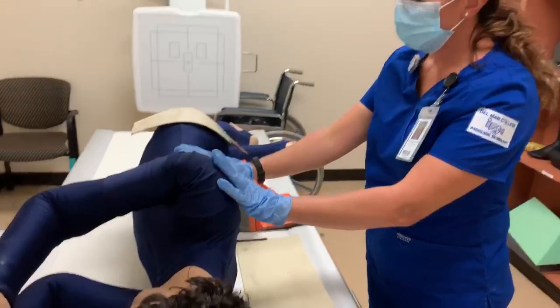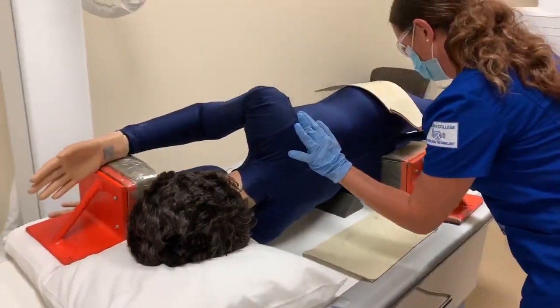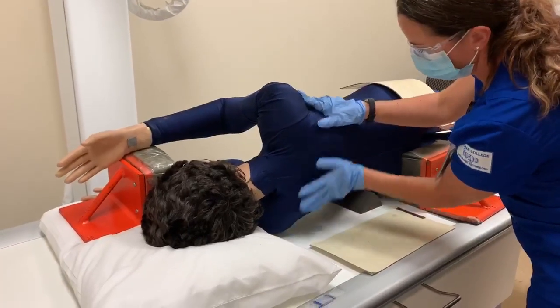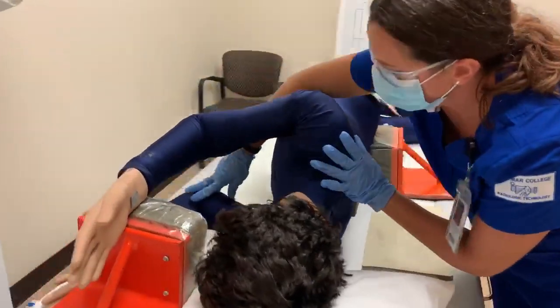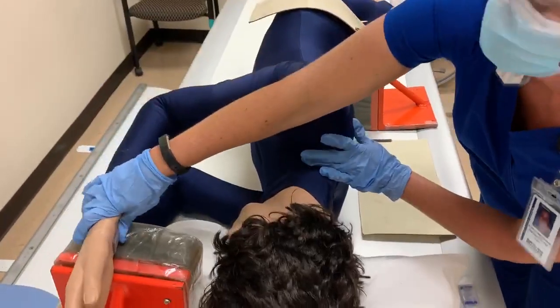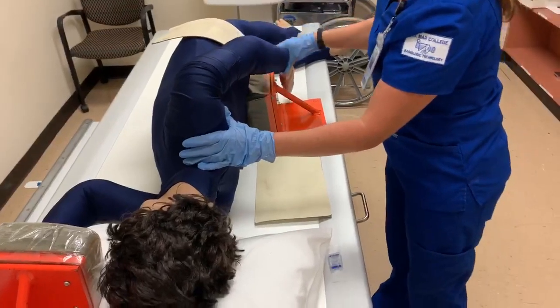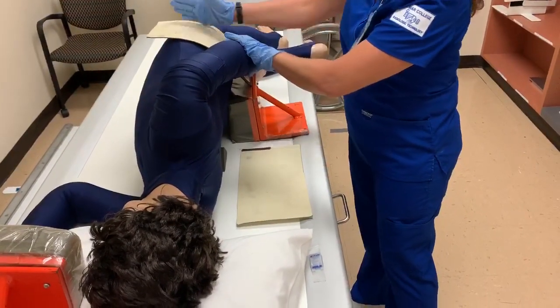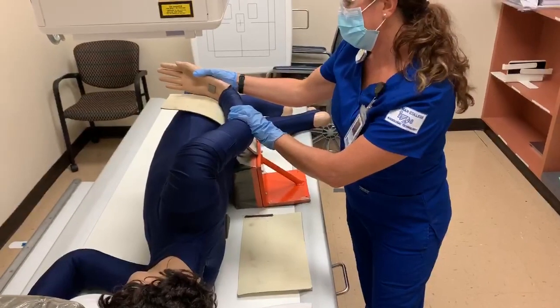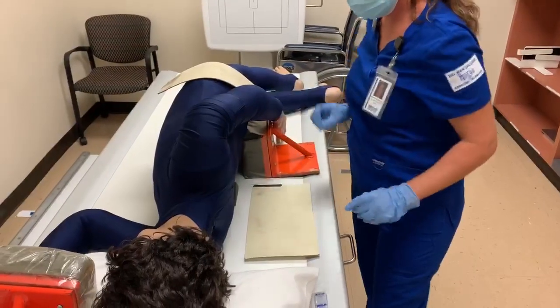So my patient is already in a lateral position. I just want to make sure that they didn't shift. Make sure she's nice and true lateral, 90 degrees. I'm going to leave her arm that's closest to the table in the praying position. The other arm, I'm going to grab it and bring it slightly backwards. With a real patient, to make them comfortable, you can bend their elbow and have them put it like this, but Molly's kind of stiff. So we'll leave her arm back.